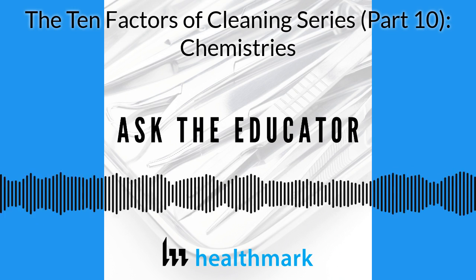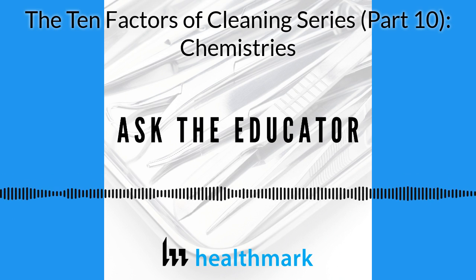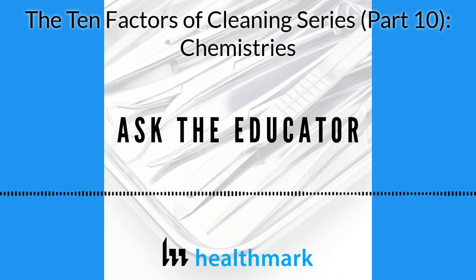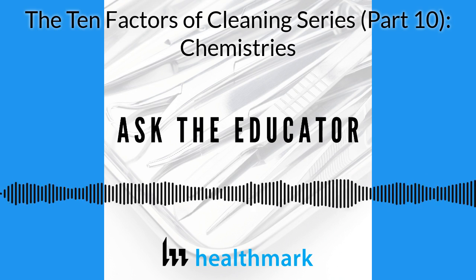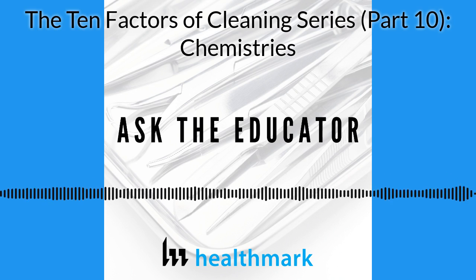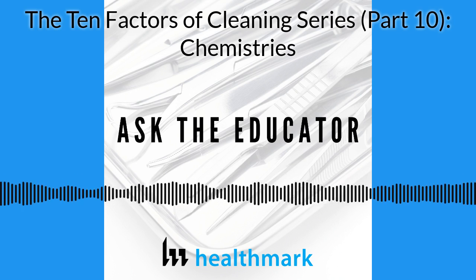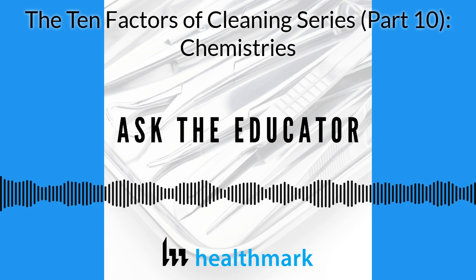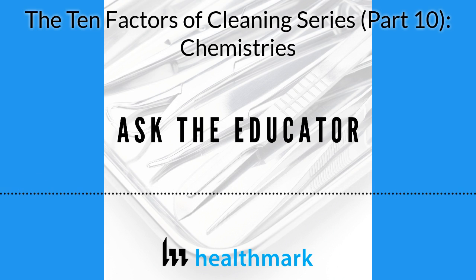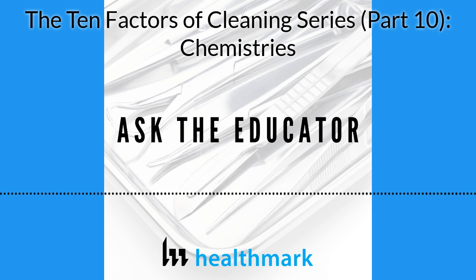So one quick thing, Kevin, I'm the sterile processing professional or medical device reprocessing professional. They must remember they're the professional. They're under a lot of scrutiny from supply chain to buy this and that. So it's up to us also to educate the people who are telling us to buy these and say, this product doesn't work for everything. Just like you said, I can buy this, but I need something else because guess what? I have more orthopedic or I have more this or whatever it is. We have to educate the people who are telling us to buy it. And that's what I wanted to leave with, that other point.